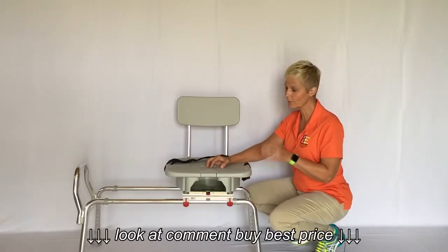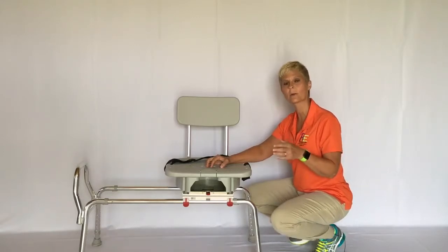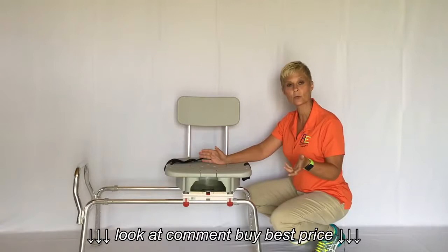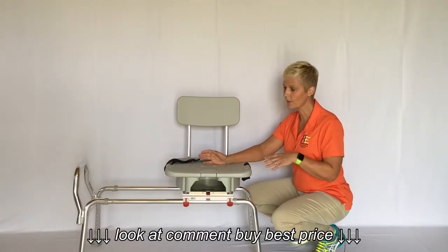I wanted to go over a few of the details before we actually put it inside a shower tub combo and a shower stall. It did not take any tools to put together — I put it together in about 10 minutes.